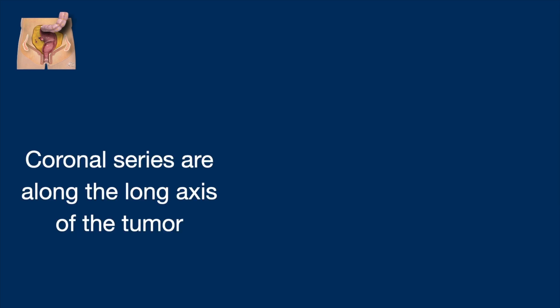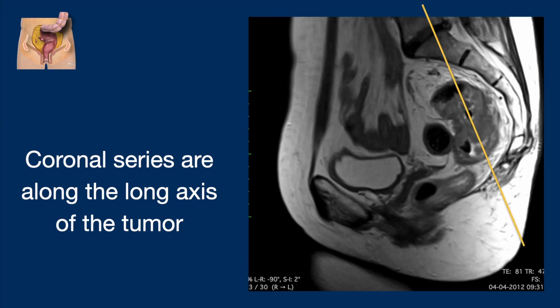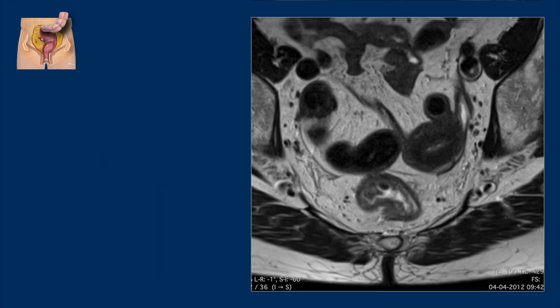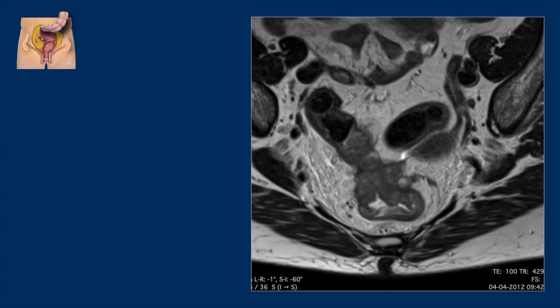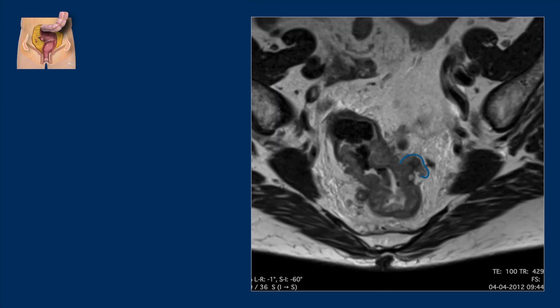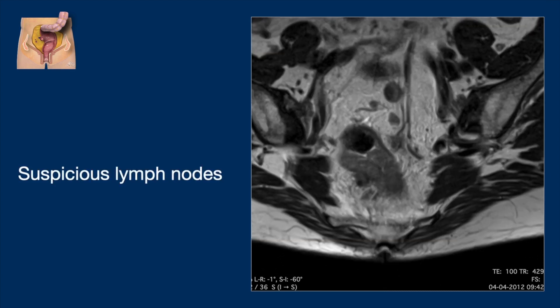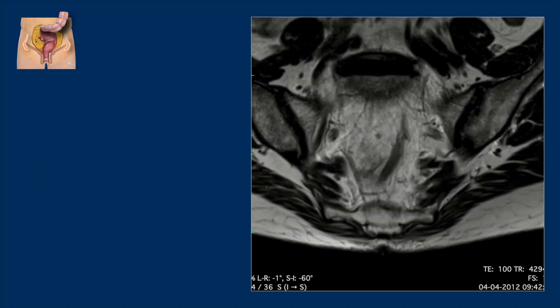Let's go to the coronal series, which are along the long axis of the tumor. Here again we see the extramural vascular invasion, and there are some suspicious lymph nodes.